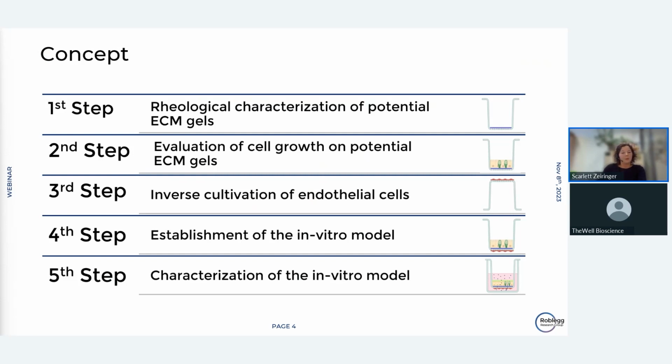In the third step, we used an endothelial cell line EAHY926 to culture them on the basolateral side of an insert via inverse cultivation. Combining the above-mentioned steps, the model was established considering the villus epithelium with the epithelial and mucus-producing cells, the ECM, and the endothelial cells.